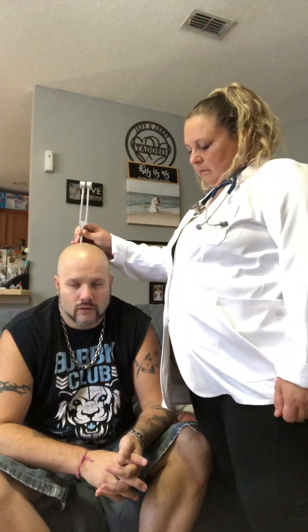Go ahead and do the Weber test. The Weber test is a test for lateralization of hearing loss. I got my tuning fork. And so what I'm going to do, sir, is I'm going to put this on top of your head, and I want you to tell me if you hear it, you'll hear kind of like a soft vibration, and if you hear it in both ears or just one ear, okay? Both ears. Okay, so that's normal.